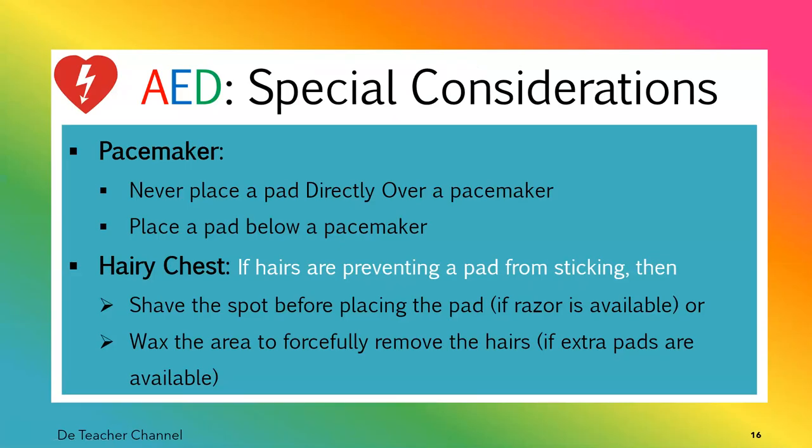Special considerations. Pacemaker. A pacemaker is an implant. Some people may have a pacemaker implanted in their heart to help their heart perform better. So never place a pad directly over a pacemaker. What you do in that case is place the pad below the pacemaker. You can still use it, but don't place the pad directly over a pacemaker.